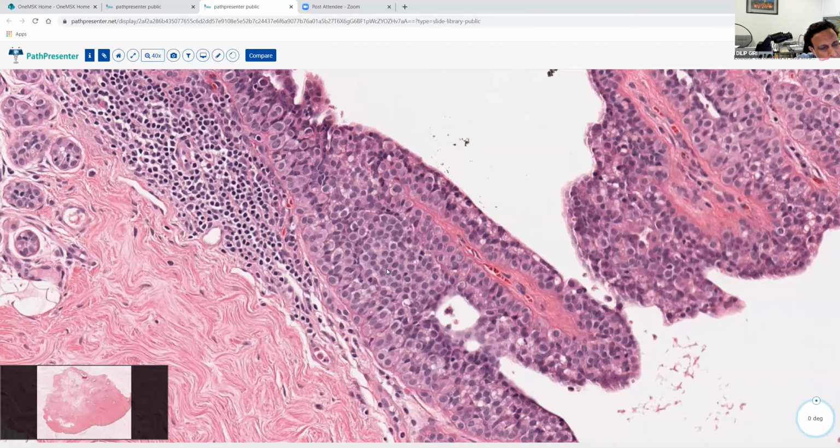So when they colonize a duct, a benign duct or a duct which is hyperplastic, then the confusion happens, and that is where the interpretation of E-cadherin is important. One should not consider that the positivity of E-cadherin somehow suggests an LCIS, DCIS mixture. So that assessment has to be morphologic. You have to be satisfied that whatever is staining with E-cadherin are really neoplastic cells. Okay, so the stain is not going to tell you that.